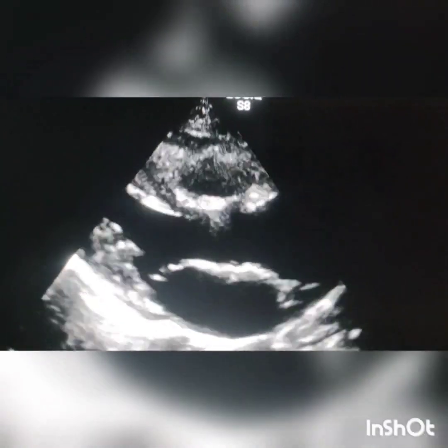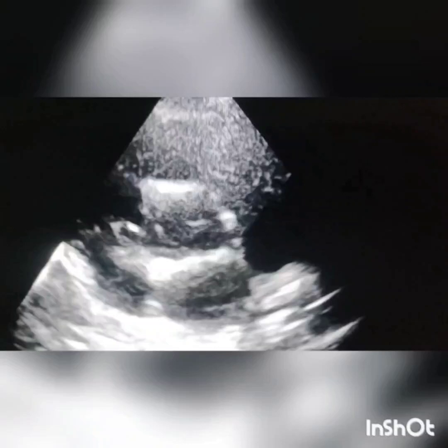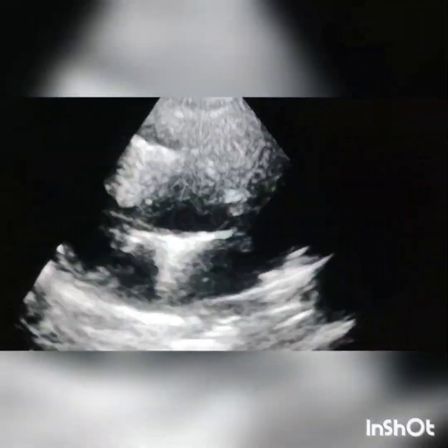The parasternal long axis view shows thickened cusps of the aortic valve with an asymmetric closure line suggestive of bicuspid aortic valve. On parasternal short axis view, the right and left cusps of the aortic valve appear to be fused with anterior posterior opening of the leaflets, and possibly there is a raphe also seen in the fused cusps, which is suggestive of type 1 in the conventional classification of bicuspid aortic valve.